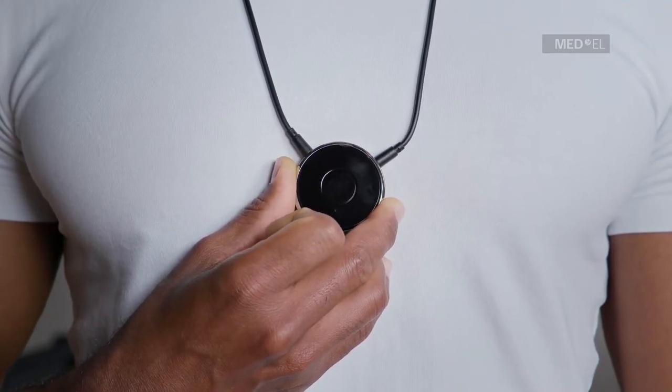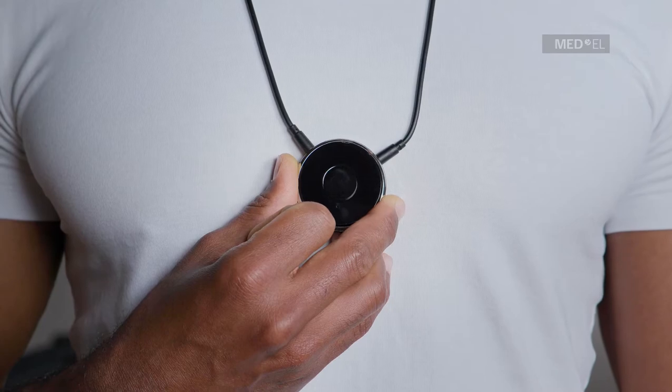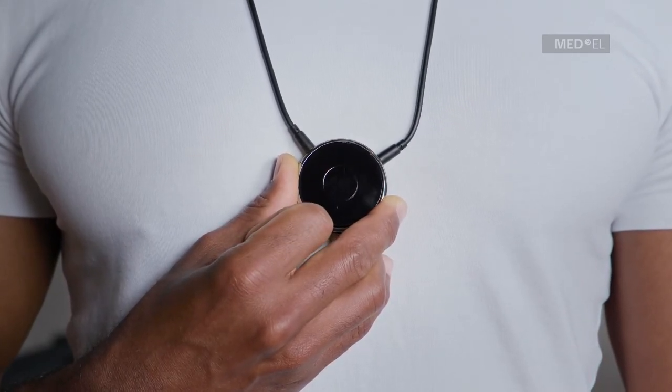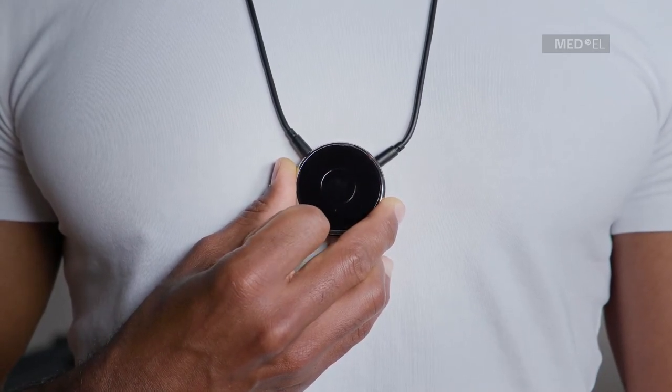To hang up on an active phone call, briefly press the multifunction button. To stop streaming the phone call through Samba2Go, double-press the multifunction button. The phone call will now be heard through your phone speaker. Double-press the multifunction button to start streaming through Samba2Go again.